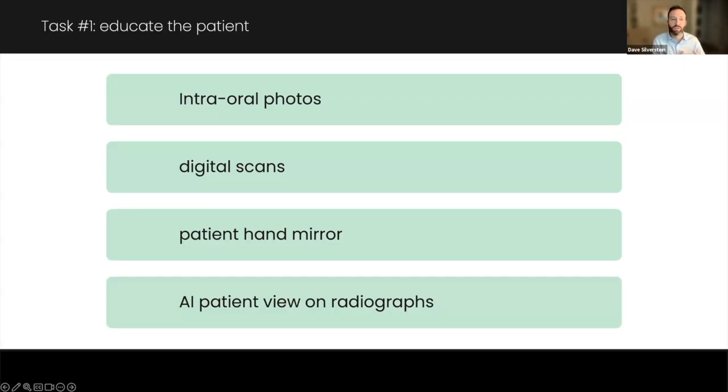So my hygienist will describe for the patient what she is seeing and then she'll say, hey, Dr. Silverstein, I was talking with George here about some of these lesions on the x-rays I reviewed with him and how they haven't made it through the enamel into the dentin yet. So if possible, we'd like to treat those with Curodont today after you take a look, right? She's just helped the patient understand we have some things that we might make a treatment plan on and what that treatment is likely to be.